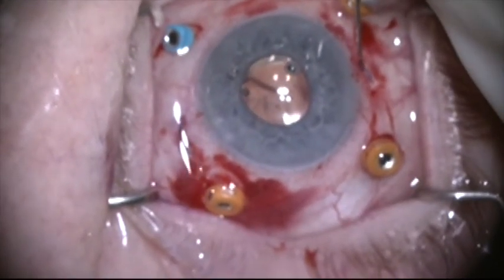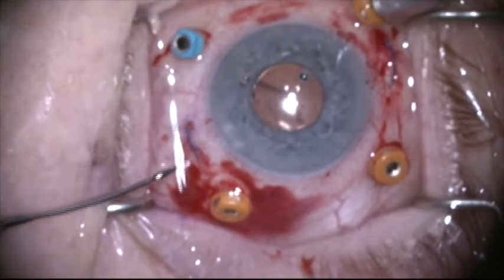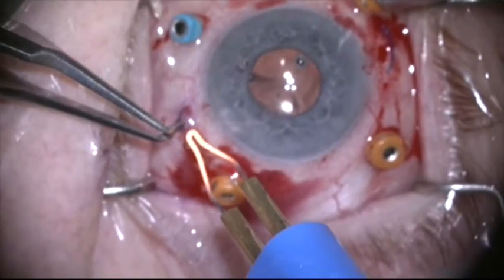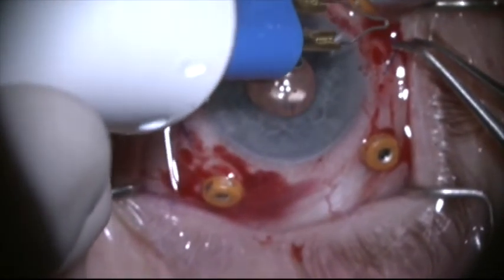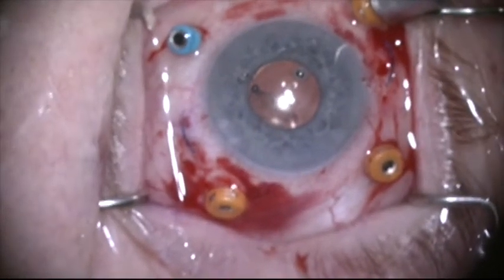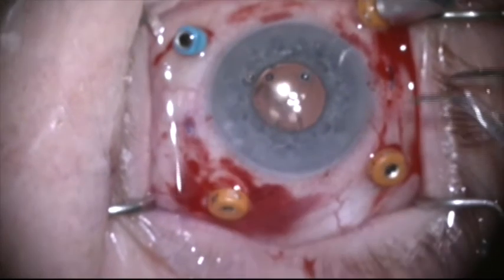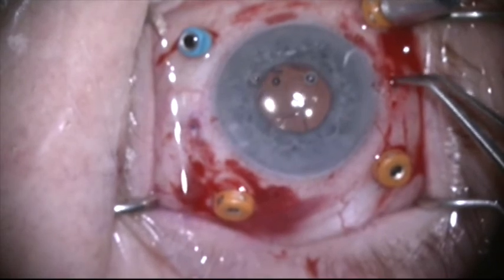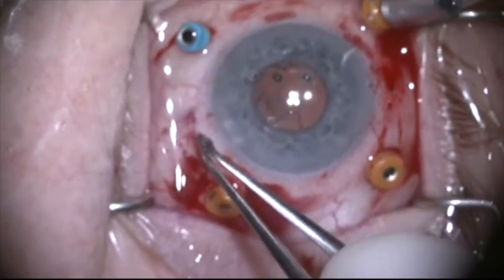Before I let go of the second haptic in my right hand, I'm going to grab the first haptic in my left hand using the forceps to secure it. Then I can pull the second haptic out of the needle — both haptics are now on the outside of the eye. I'll use a cautery to melt the tip of the haptic into a little mushroom. You don't want to melt it too big, otherwise it won't slip into the tunnel well — just big enough to prevent the haptic from falling back into the eye. I'm now going to push the haptic into the scleral tunnel made with the needle, monitoring the position of the lens as I do this. If the lens did not center perfectly, you could re-center it by cutting the haptic a little shorter on one side and re-melting it.